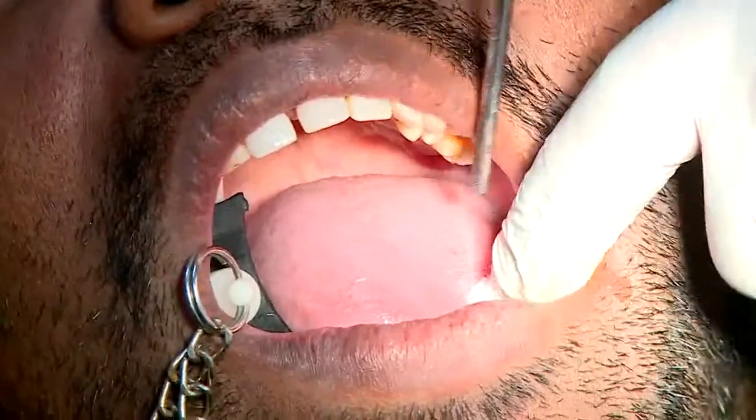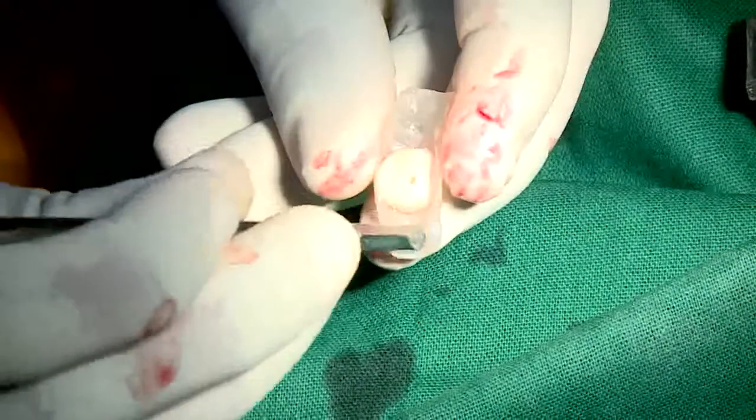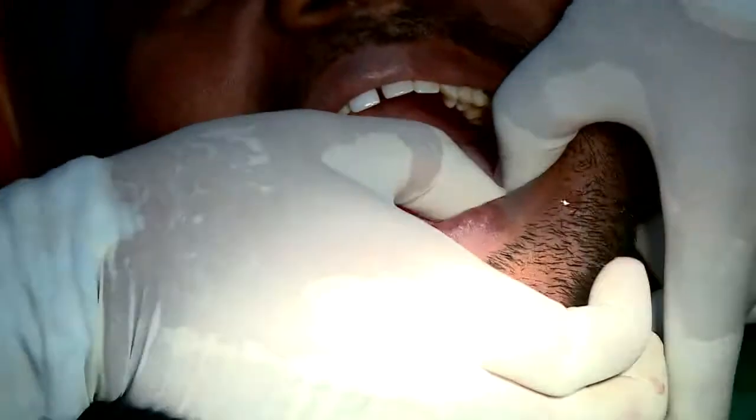11.5 is fantastic. Now, our people have made a small surgical stent. Can you just focus on this, please? If you see, this is actually nothing apart from, on the undersurface, a part that sits on the premolar and on the second molar, and they have just placed one acrylic tooth. If you place it in the patient's mouth, it fits very well.